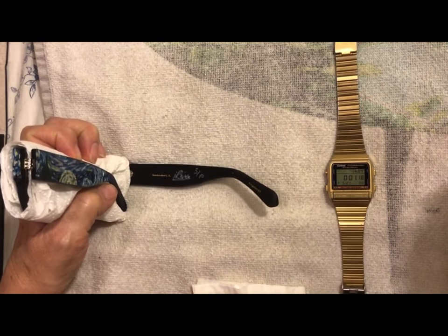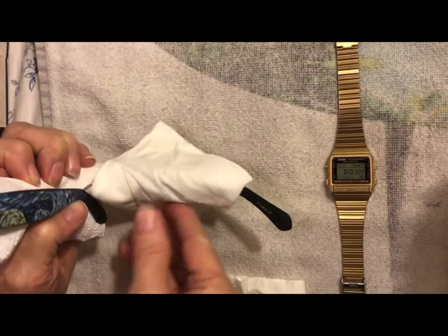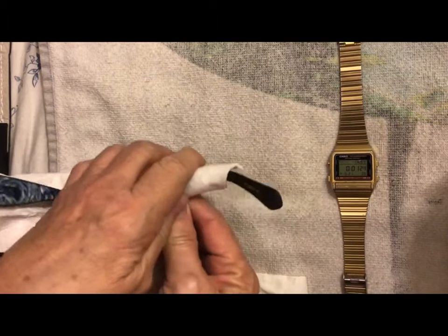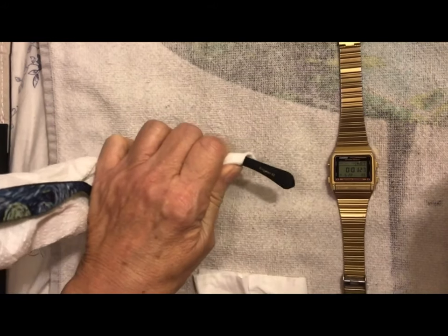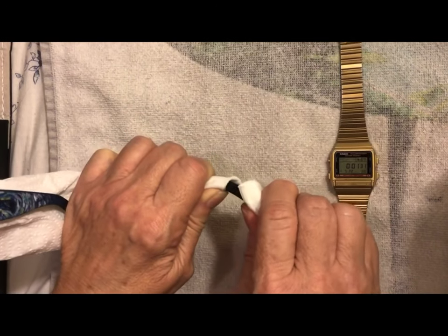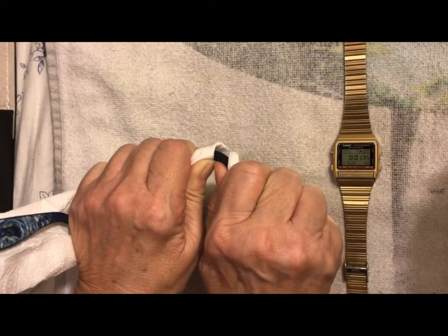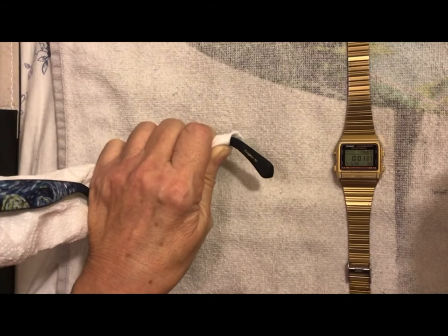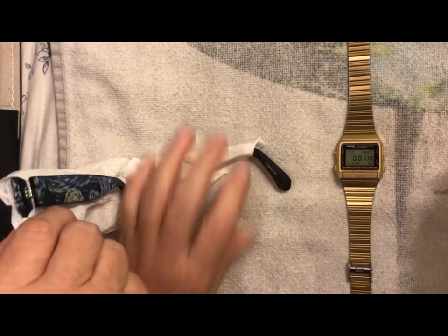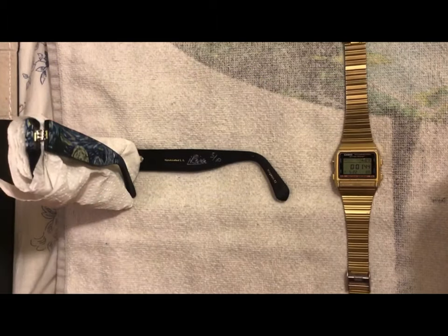Once she heats it up for a minute, even my mom is able to handle it. She puts a little cloth over the frame because it's kind of hot, but she puts her thumb down, gives it a go — and that's how my mom adjusted her own glasses. This is pretty much easy self-service, guys.